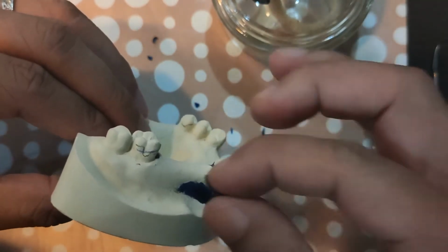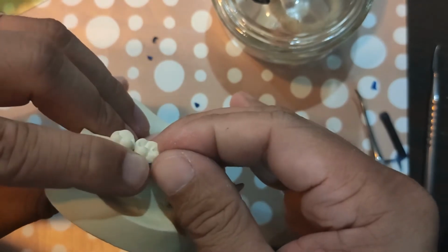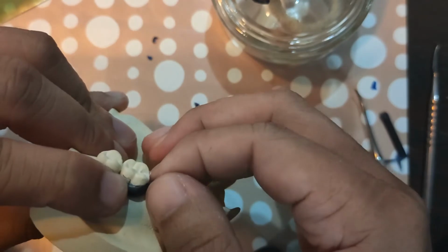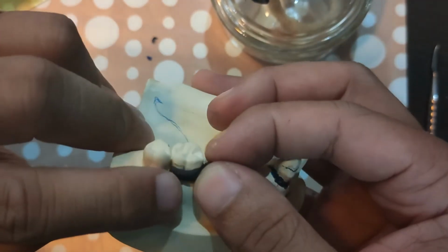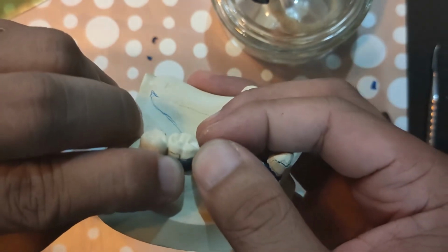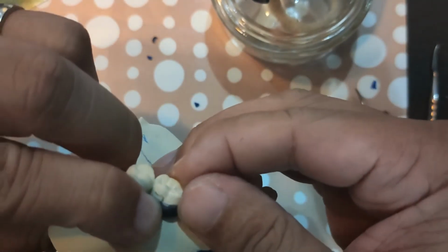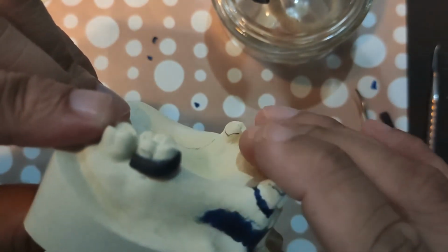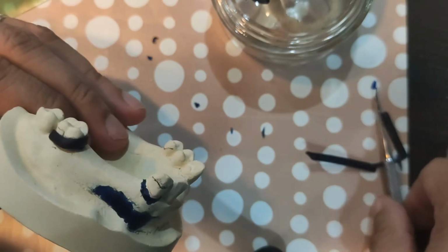So I just use this, my half round modified, and I follow where that blue line is, where I marked. It's okay to be excessive dito pagdating dito sa proximal because you're going to remove it anyway. Right, so that's the ledge. Next is we're going to lute it.